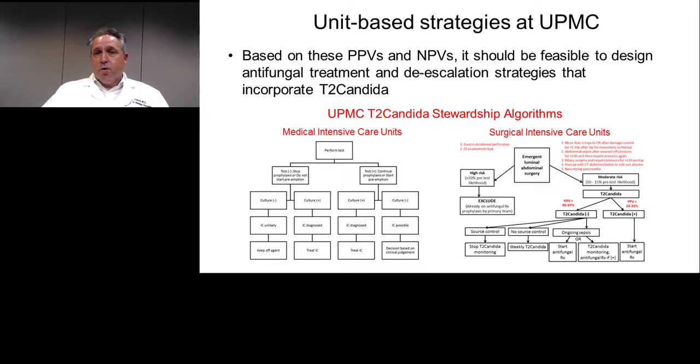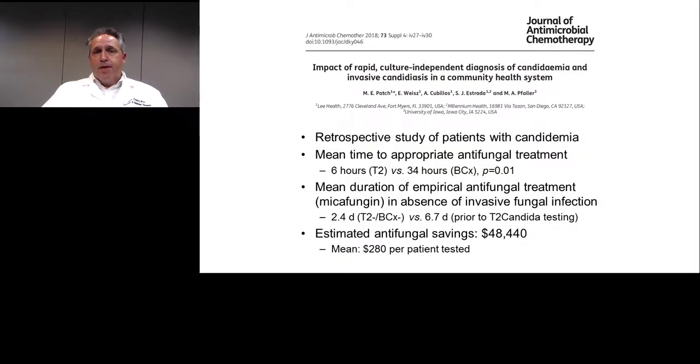So one size does not fit all, but a unit-based strategy is what we've employed. The benefit that we've seen in our pilot studies has been reported elsewhere. So here's another example published recently in the Journal of Antimicrobial Chemotherapy. This was a hospital, a healthcare system, a series of hospitals in the southern United States that instituted T2Candida testing.